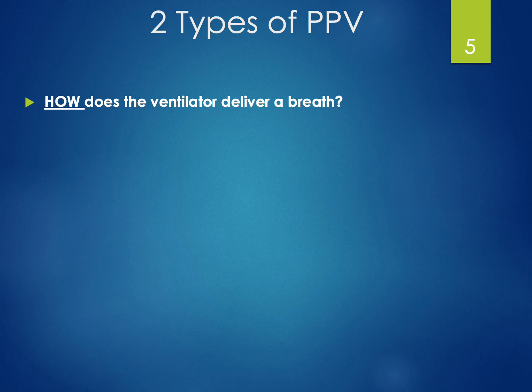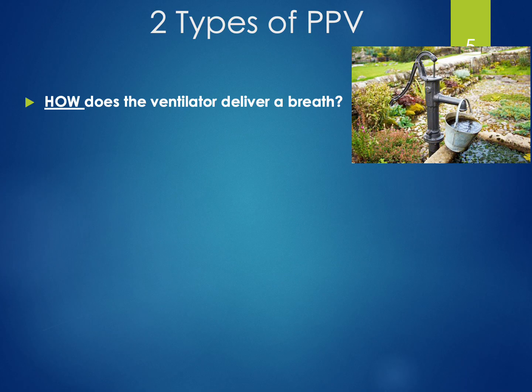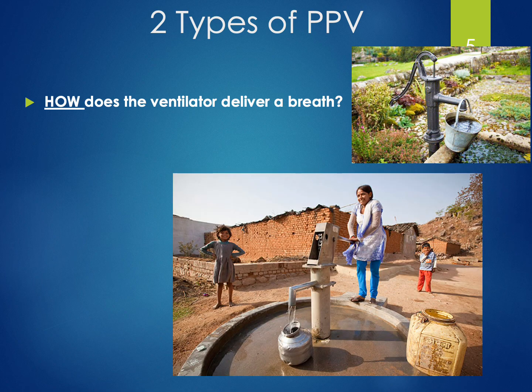And this might sound confusing to you. It's just pushing air into the patient. What do you mean volume or pressure? Well, let's look at it this way. Here we have a water pump. And you may or may not have used one of these before, but essentially you push down on the lever to get water to pump out on the other side.